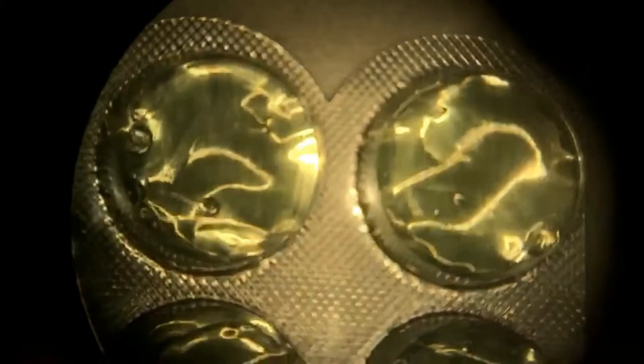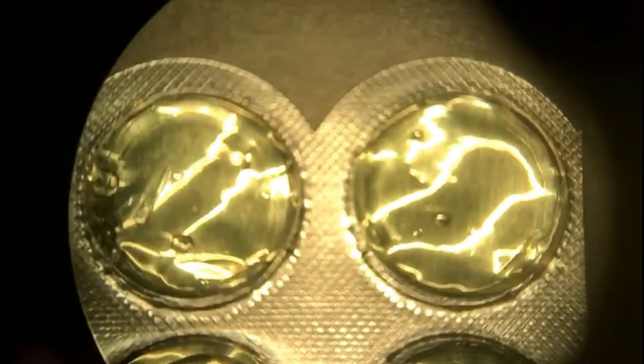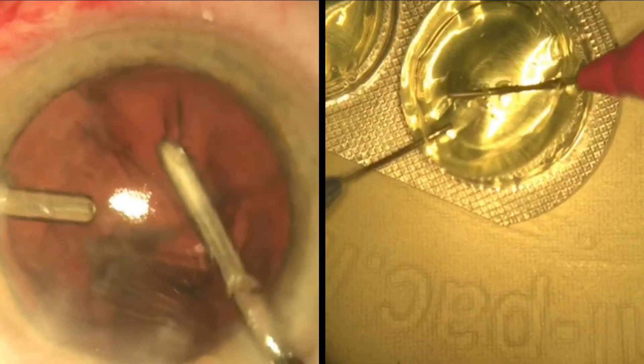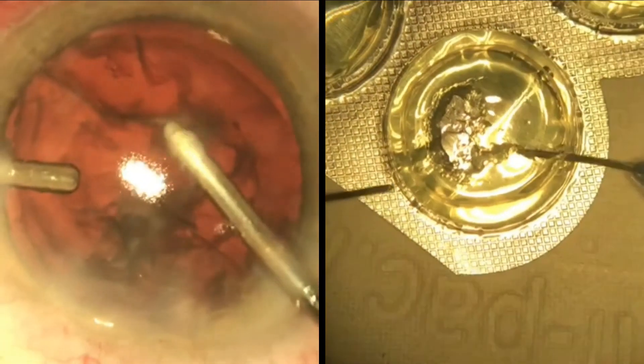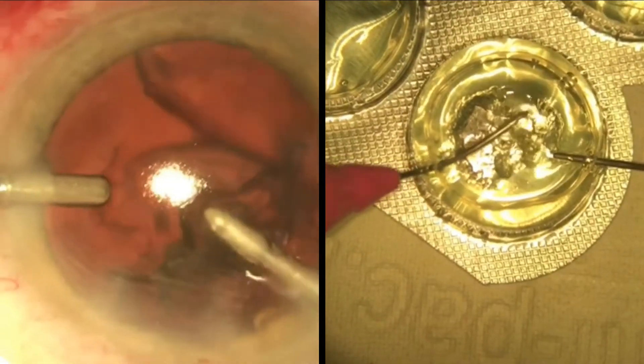For imitating lens cortex removal, we have used jelly filled lozenge packets. The bi-manual irrigation and aspiration probes are inserted via the side port and pivoted around this entry point during the procedure to approach all portions of the jelly for its removal.